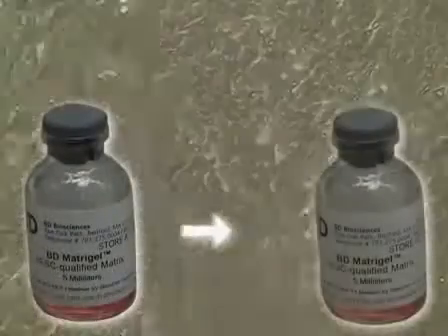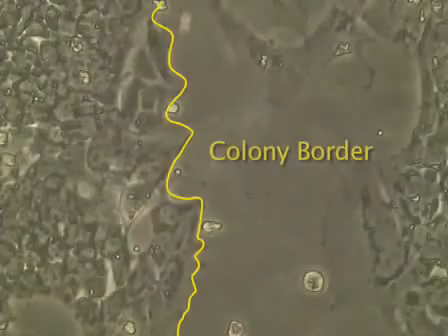To split human embryonic stem cells grown on Matrigel to Matrigel, we start with a confluent 6-well plate of embryonic stem cells on Matrigel, which can be split 1 to 3 to 1 to 5 to another Matrigel plate. This allows the wells to become confluent again 4 to 5 days after splitting.